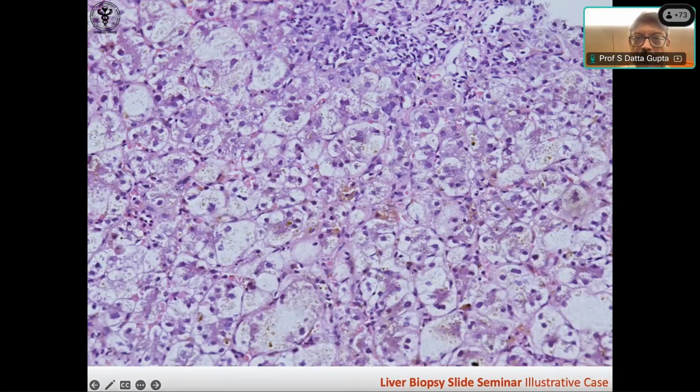And then let's go here. Yeah, there it is. They're all inflammatory cells. This is all cholestasis, ballooning. Yeah, there's large cells here, here. 1, 2, 3 nuclei in this. 1, 2, 3. These are cells, you see, 1, 2, 3 nuclei in this balloon cells, large cells.